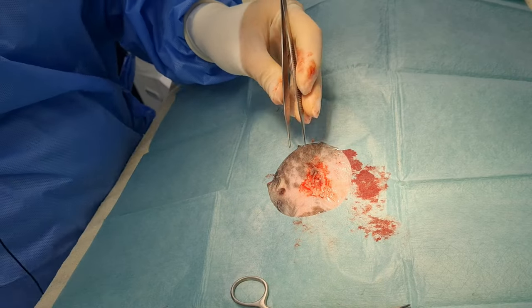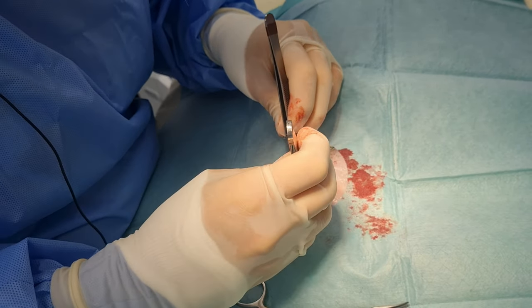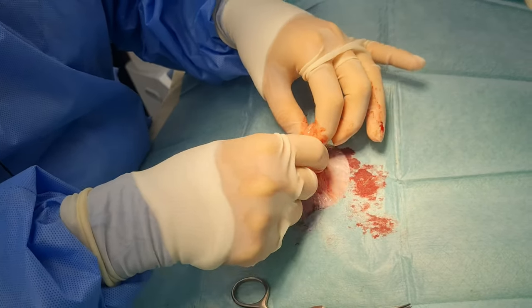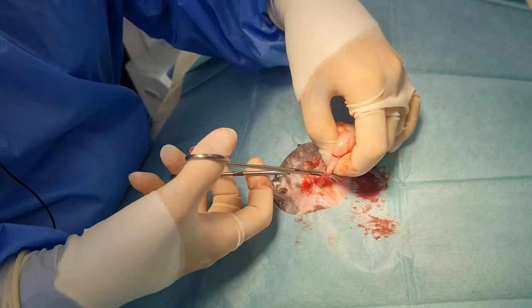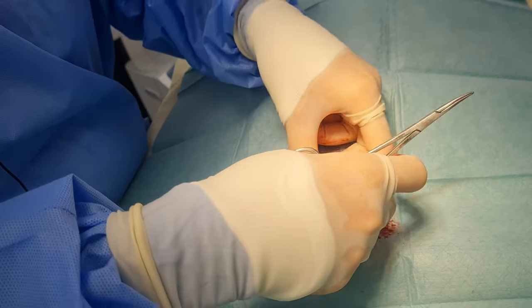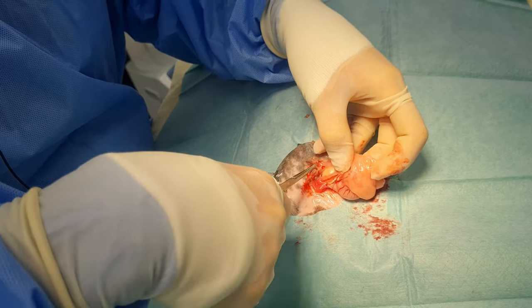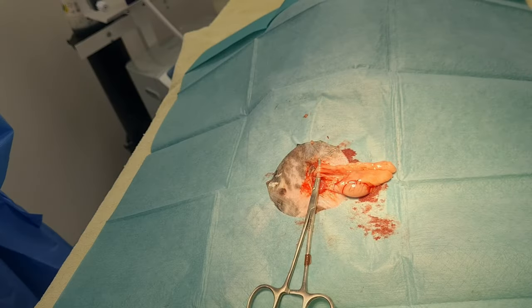That can go back in as well. Knowing where to find the right bit of tissue is difficult until you've done it. The fat pad is usually just sitting there — it's a different consistency, a bit silkier, a different texture. The fat pad comes down and the blood vessels are in it. The cord is our vas deferens, along with our blood vessels. We can just clamp those off and then ligate them as standard.